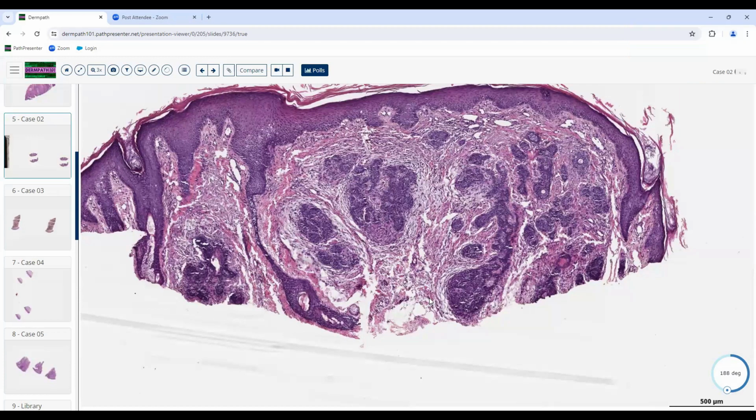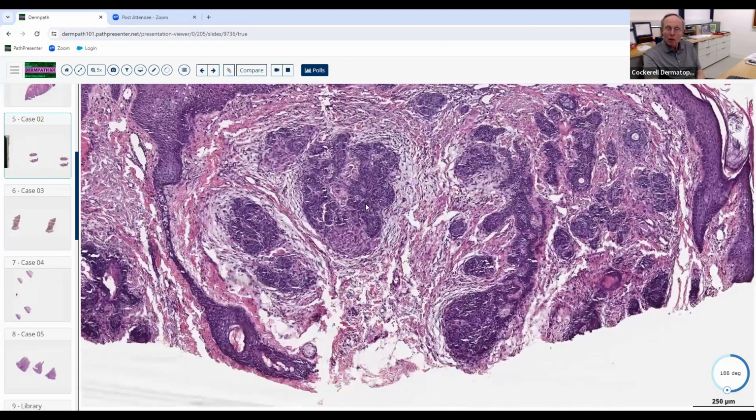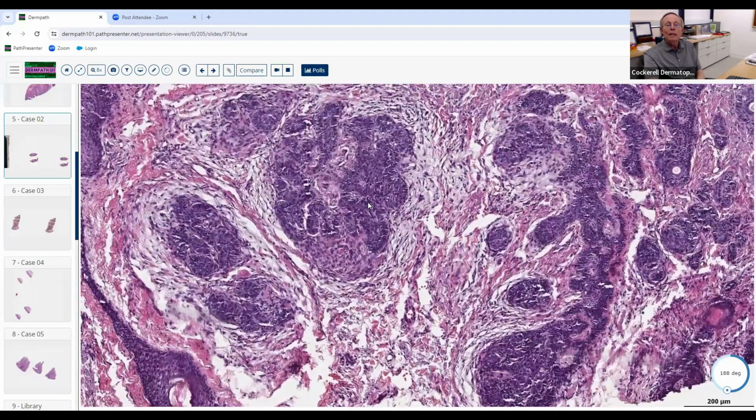You get a mutation in it, and then because those are pluripotential cells in essence, they can form a sebaceous gland, they can form an apocrine gland, they can form a hair follicle, they can form a tricholemmal follicle, a lesion like we just saw, they can form this lesion like we saw. So that's most likely where these are coming from. And that's why they don't all look like the textbook. They can all look a little bit different.